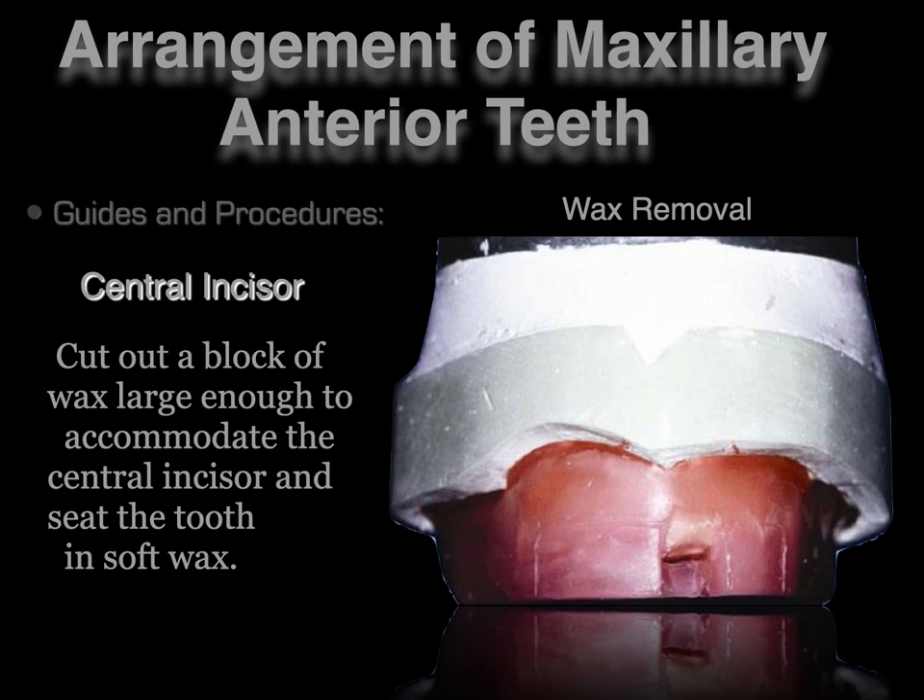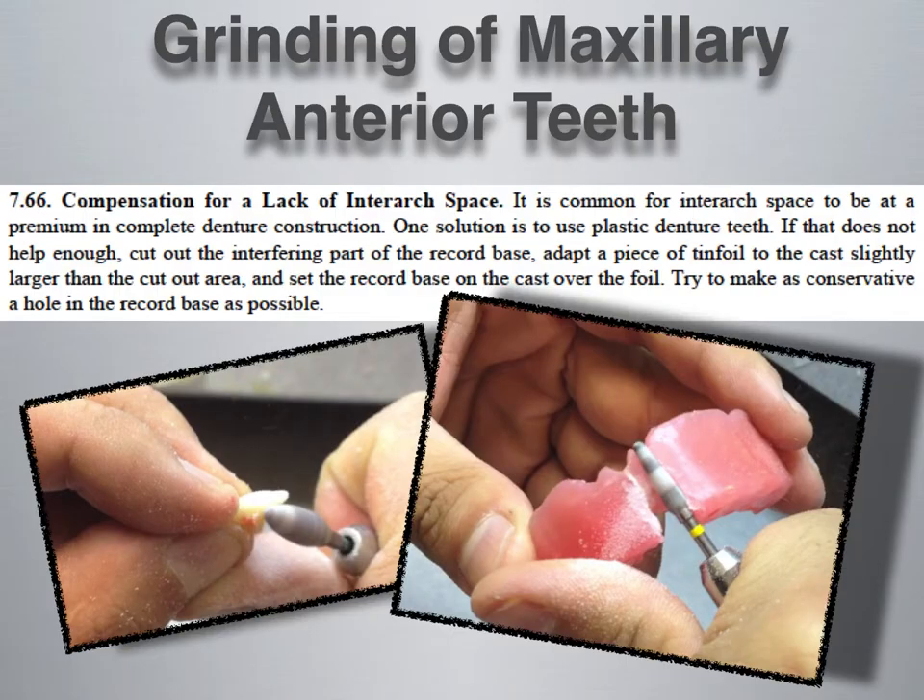According to the Air Force manual, cut out a block of wax large enough to accommodate the central incisor and seat the tooth in soft wax. One of the most important things when setting teeth is space. We have spoken about porcelain versus acrylic teeth, and using acrylic teeth is directly correlated to situations where there is not a lot of restorative space. So if a denture has very little vertical dimension, teeth may need to be ground in order to match the size and shape of the occlusal rim.